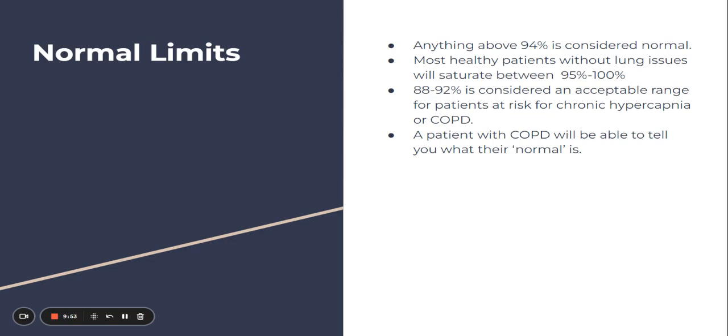Looking at normal limits, anything above 94% is considered normal. Most healthy individuals will have saturation between 95% and 100%. Most of them will have 98% and more.